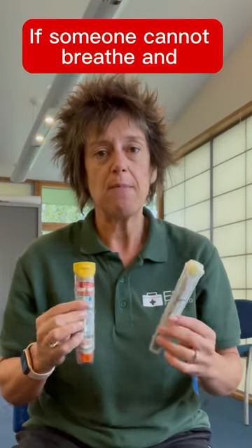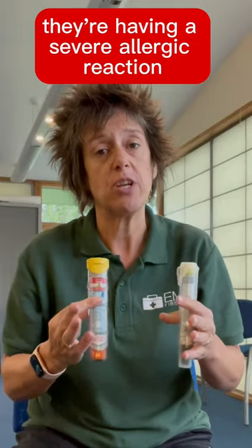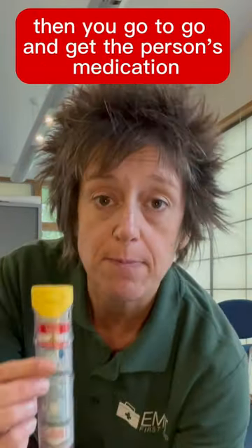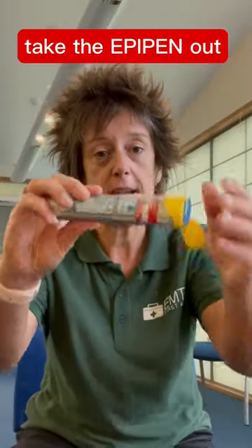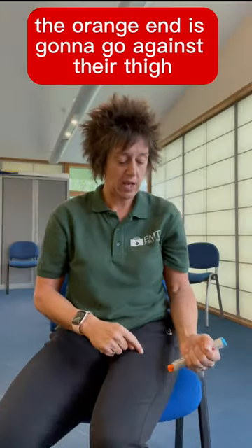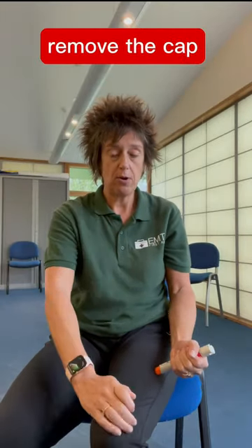If someone cannot breathe and they're having a severe allergic reaction, the first thing you're going to do is call the ambulance. Then go and get the person's medication — the EpiPen. Take it out of the case, the orange end is going to go against their thigh between the knee and the hip, remove the cap, and hold the leg.